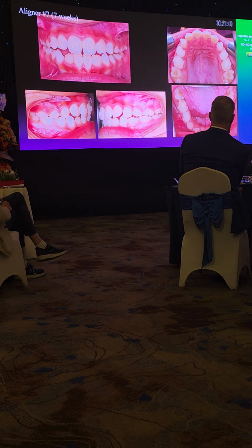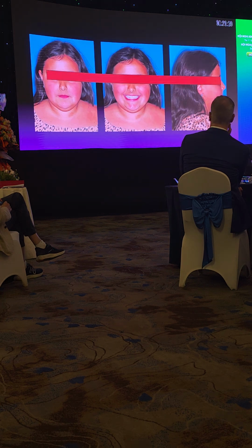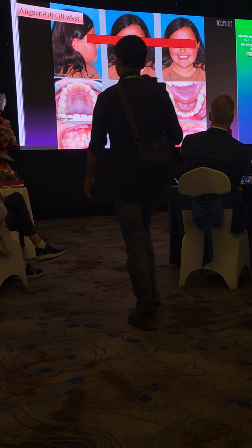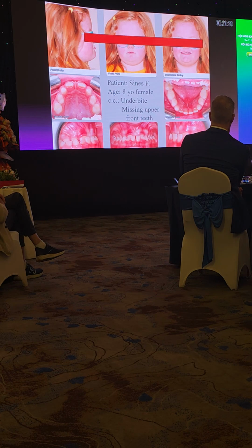So 7 weeks, okay, now each aligner just 1 week, all right? You don't need to go 10 days or 2 weeks, just 1 week. So 10 aligners, all right, that's how she looks like. 10 weeks, you already jumped the anterior crossbite in 10 weeks, all right? So you check the occlusion, all right?